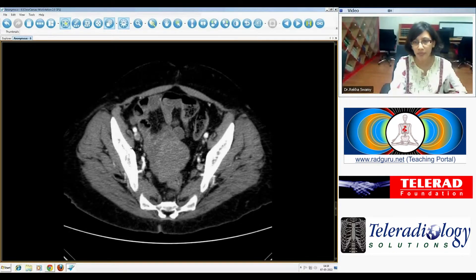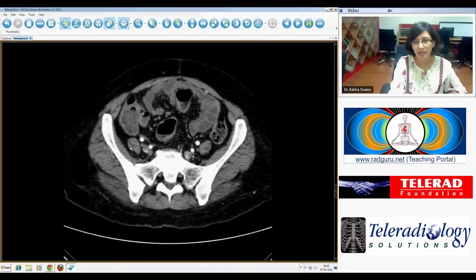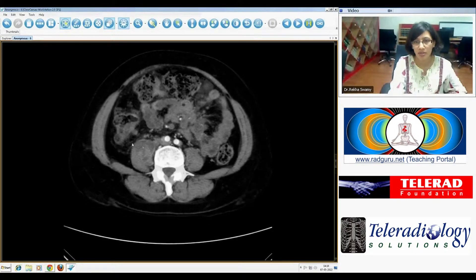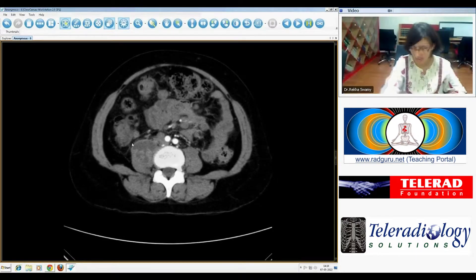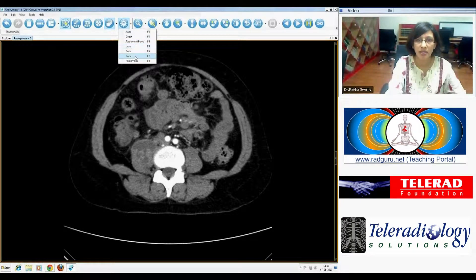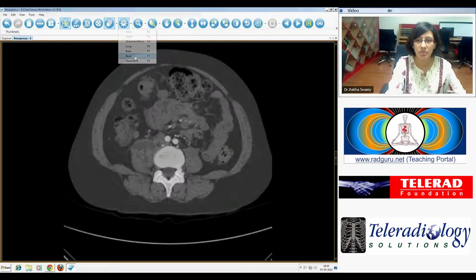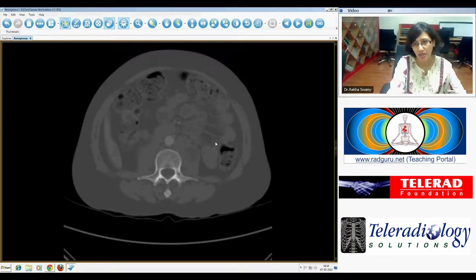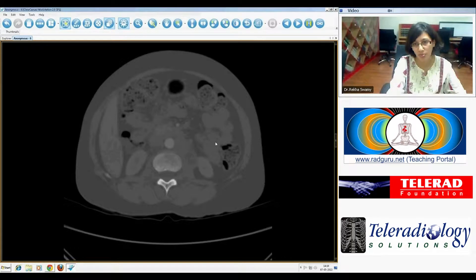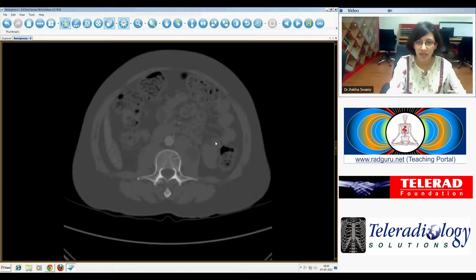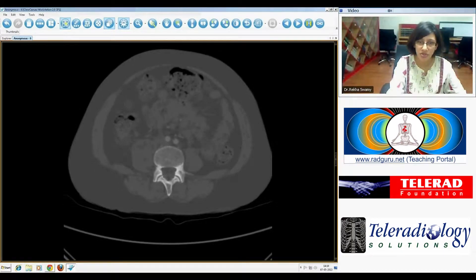Looking back at the psoas abscesses, we just need to make sure there's nothing within the vertebral bodies, like a discitis, which could be leading to these abscesses. I've changed the windows to bone windows and can't actually see any destruction of the adjacent bone.